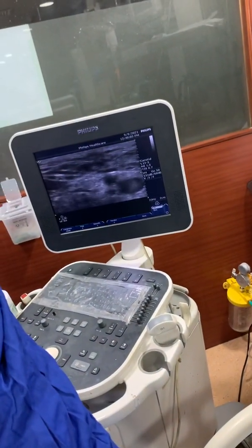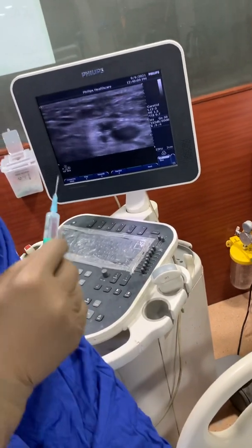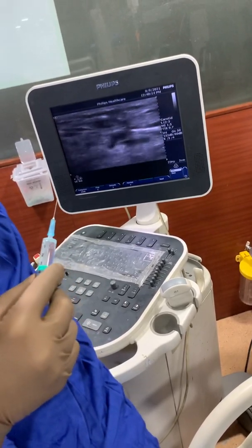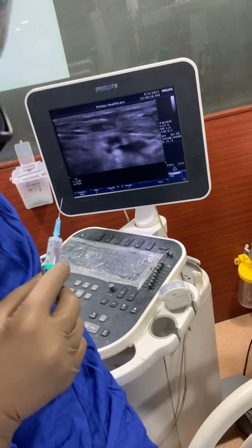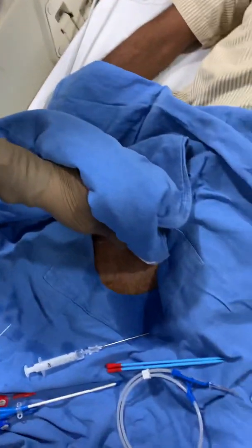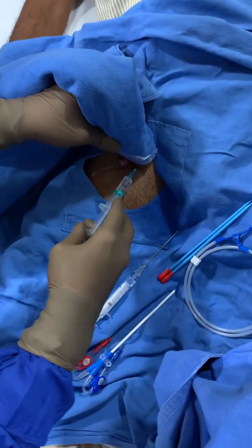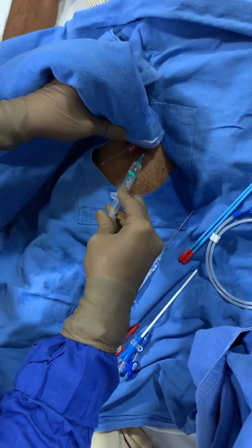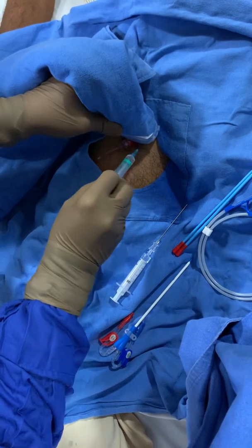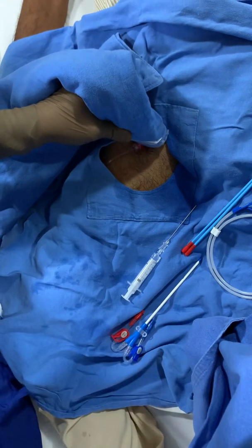We are going to place a femoral double lumen dialysis catheter, and the whole procedure is being done under ultrasound guidance. As we can see on the screen, the collapsible structure is the right femoral vein. We are slightly constrained with space as we have an artery line placed just to the side, placed just prior. I have now infiltrated the local anesthetic.